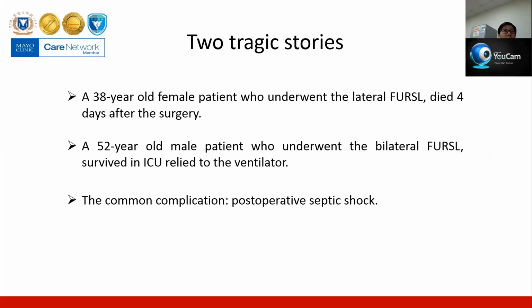At the beginning of my career as a urologist, I heard two tragic stories. One story is a 38-year-old female patient who underwent bilateral flexible ureteroscopy lithotripsy, and she died 4 days after surgery. Another is a 52-year-old male patient who underwent bilateral FURS, and survived in the ICU reliant on a ventilator. These two cases occurred respectively in two large medical centers in our city. And then I realized that flexible ureteroscopy lithotripsy is more dangerous than I imagined.